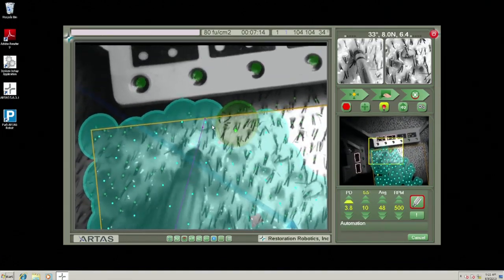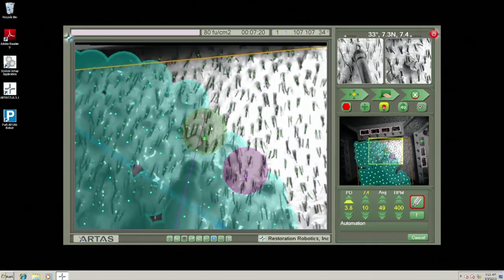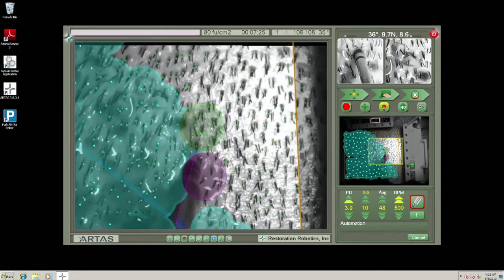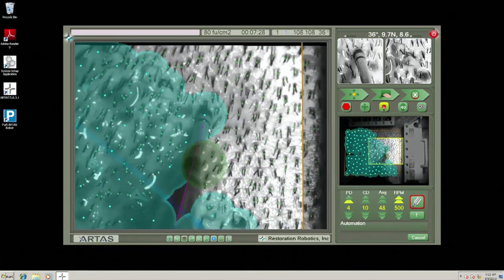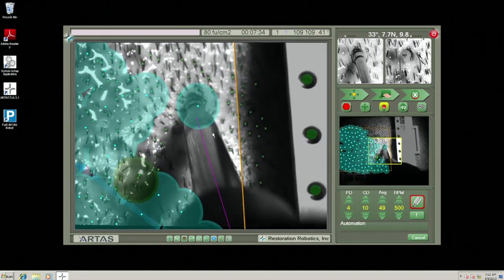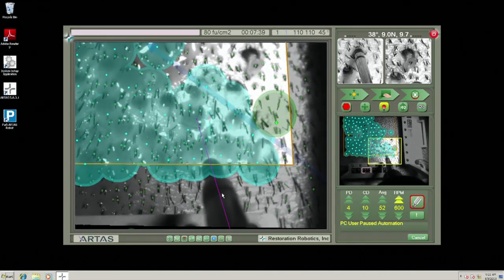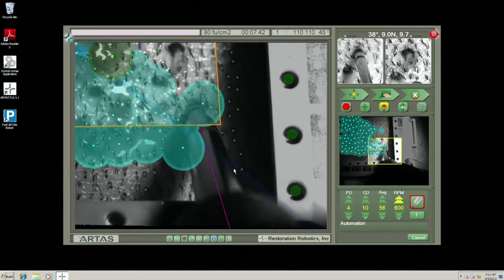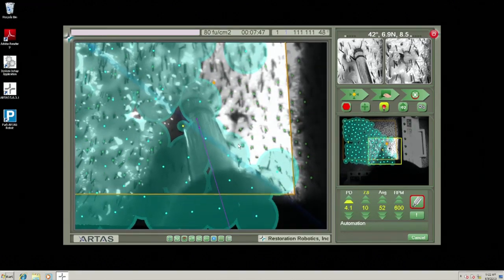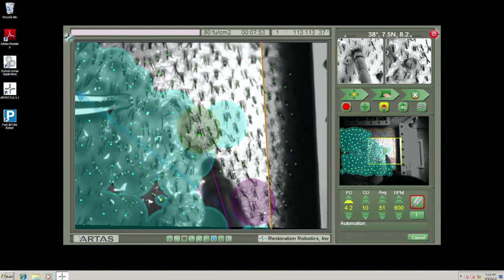That's correct. So you have dots. You have multiple dots in each circle, right? You have green dots, and those green dots may be as many as 9 or 10. So it's safe to assume that even at a very aggressive harvest rate, we're still only taking 1 in 9, or maybe 1 in 10 hair follicular units in the donor area, and that's despite having extremely aggressive parameters. We can still come back in that area and not have to worry about over harvesting. We can come back in this area even 2-3 times if we need to.